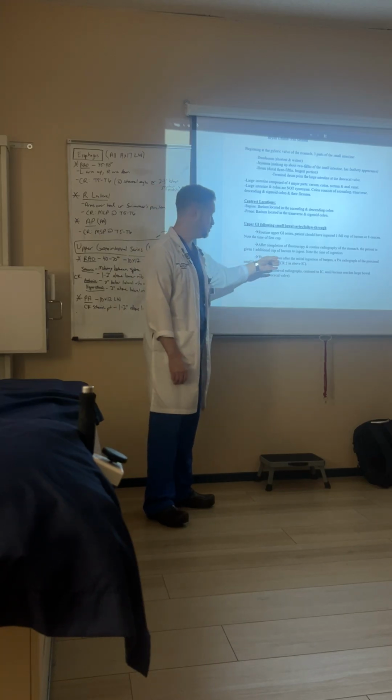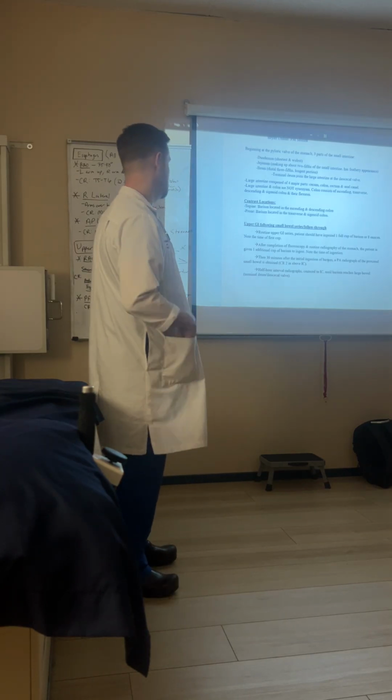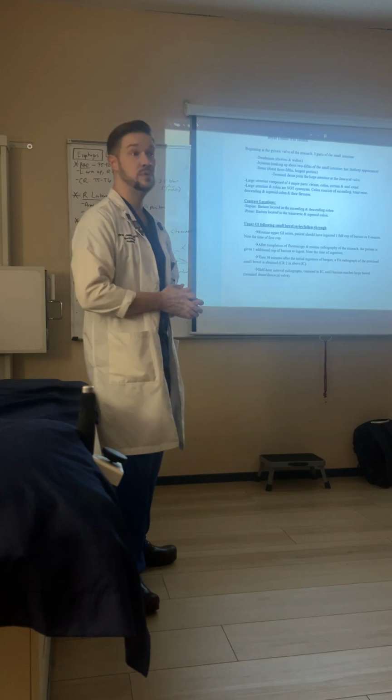So 30 minutes after the initial ingestion of barium, we're going to take a PA radiograph of the proximal small bowel. Why PA? Why not AP?